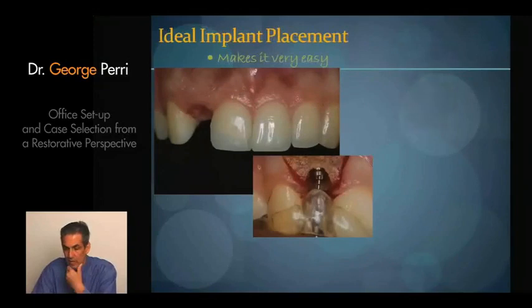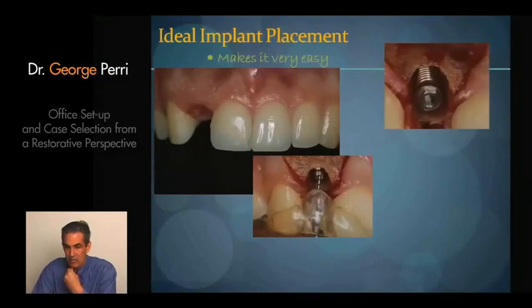So here we see an example of the head of the implant placed, and you see this large space around the implant, and you think, well, that's not good, we need a larger implant. The next thing I really want to think about is the biologic predictability of the bone surrounding the implant. The only thing a larger implant does on this case is reduce the biologic potential. The less bone that we have in that area, the less soft tissue support, the less support to the implant itself. So we really don't want a larger implant.